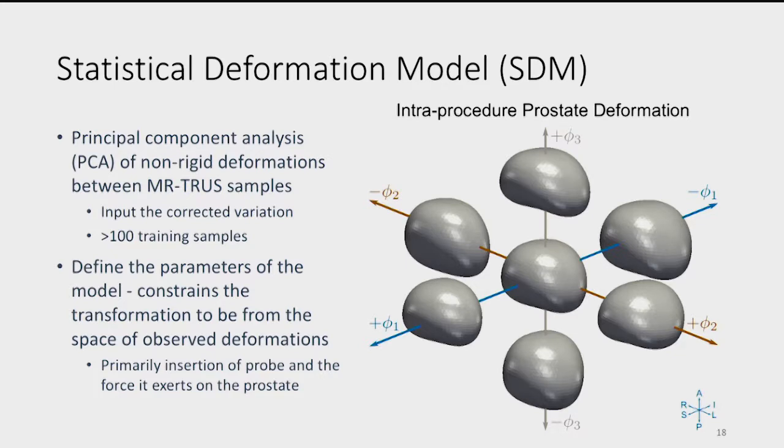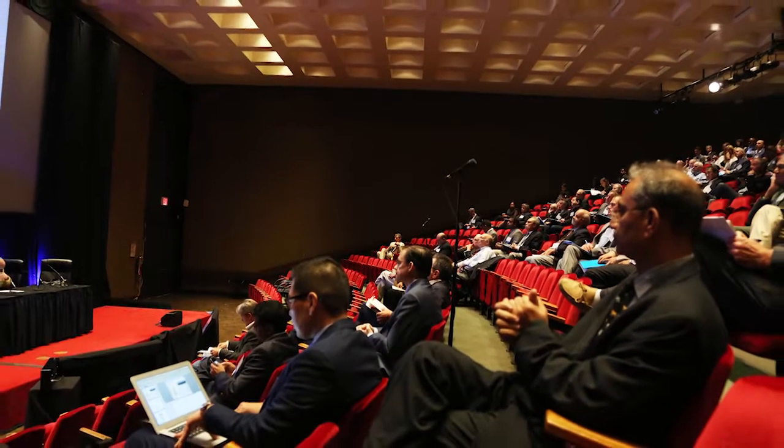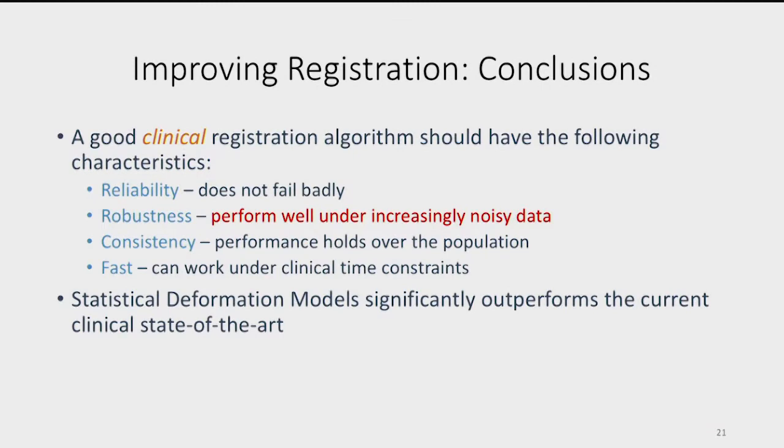But you should watch. So if you're at the peripheral zone, you have a posterior lesion, and you fire, and it's a very dense, high-grade disease, it could bounce off. So you need to keep your eyes on the ultrasound. I'm not talking about needle deflection. I'm talking about the prostate gland. No, that's what we're saying. We realize that's exactly what you're saying. Yeah, that's what we're talking about.